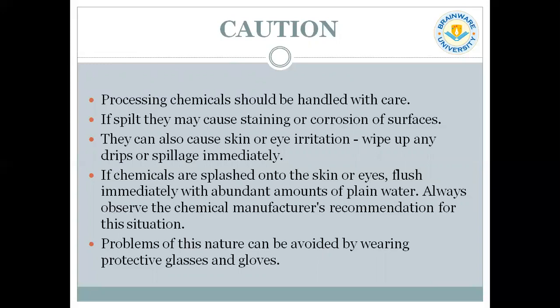They can also cause skin and eye irritation. So once it happens, you have to flush immediately with an abundant amount of plain water. And always observe the chemical manufacturer's recommendation for this situation. This kind of problem can be avoided by using protective glasses and gloves.